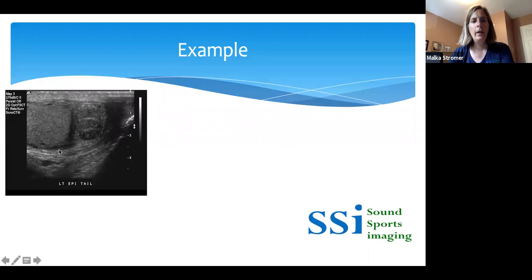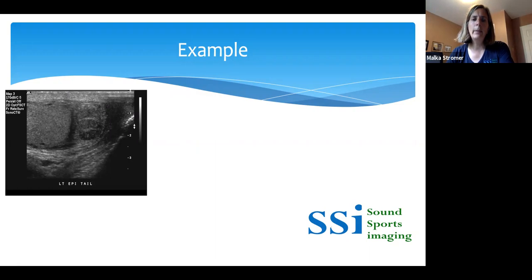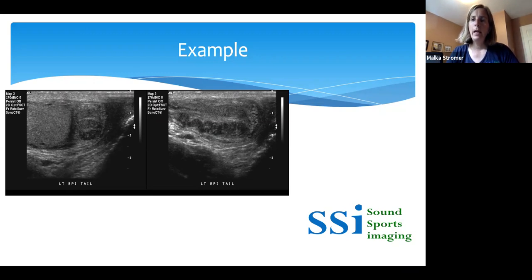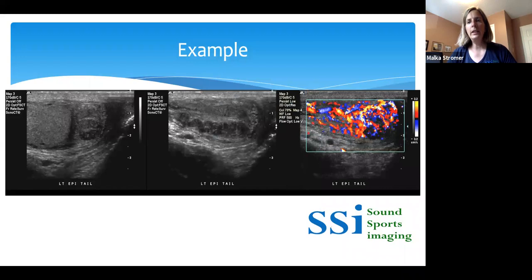Here's another example — the left testicle with a hypoechoic area in the region of the epididymal tail. It's not often that we visualize the epididymal tail, so the fact that it appears quite hypoechoic and enlarged is significant. Turning long on it, we can see how enlarged and hypoechoic this epididymal tail is. In a patient with acute onset of scrotal pain, elevated white blood cell count, and middle-aged male demographics, putting on color Doppler shows extreme hyperemia associated with this epididymal tail. This is a case of epididymitis.